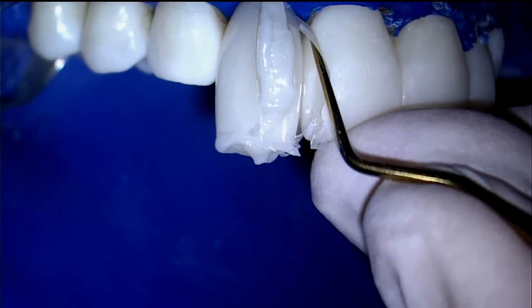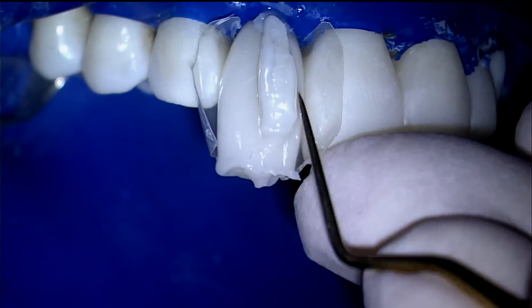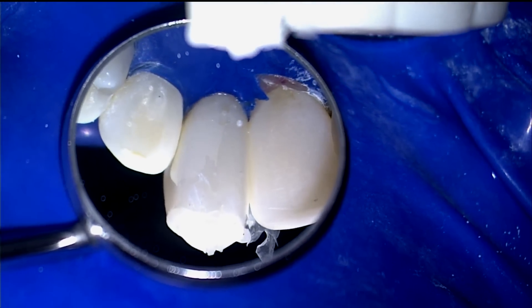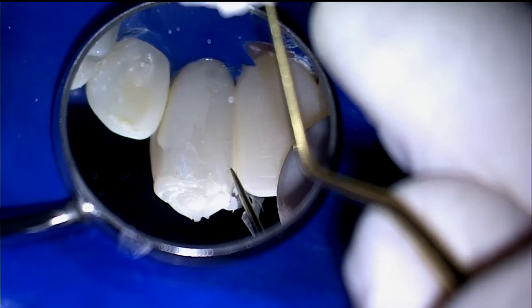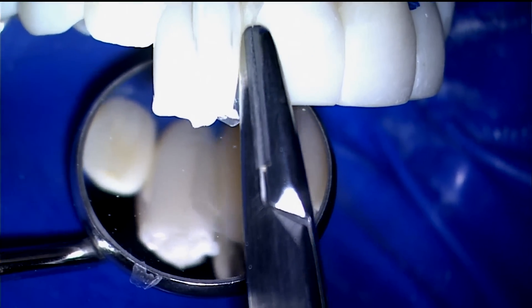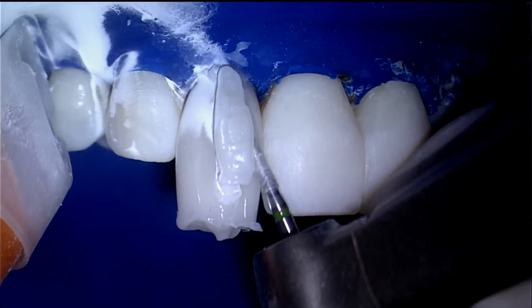The straight end of the Clark Explorer is used to release the matrices on both the facial and palatal. The hemostat is then used to spin out the matrices. The coarse flame diamond burr chops off the vestige.